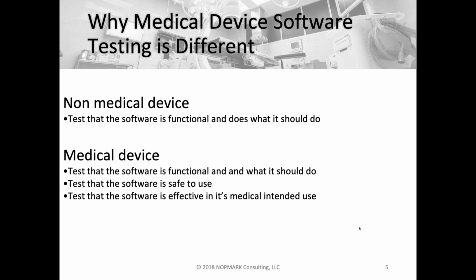We still care about the software doing that functional aspect, but we now start branching off into a couple of additional areas. The big one is what we mentioned, which is safety. Is the software safe to use? And if misused, can it cause any issues?